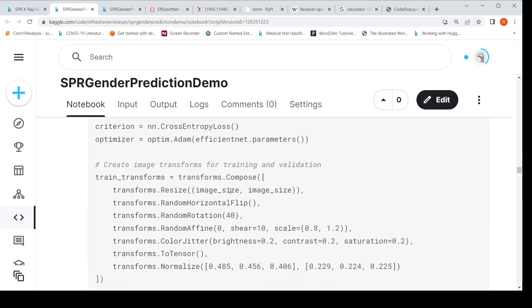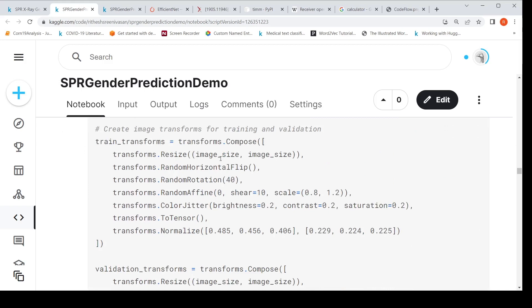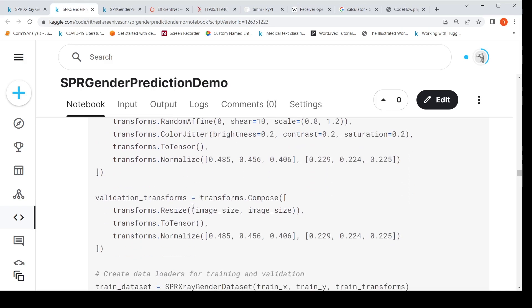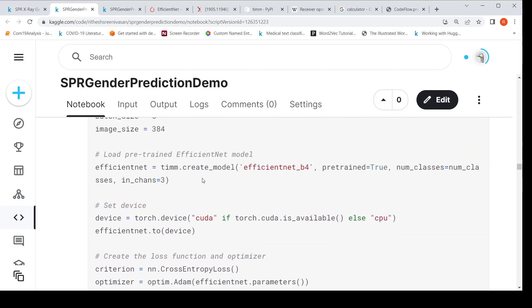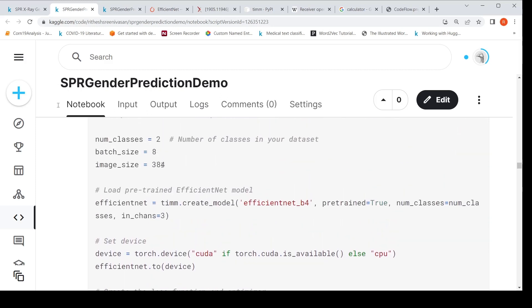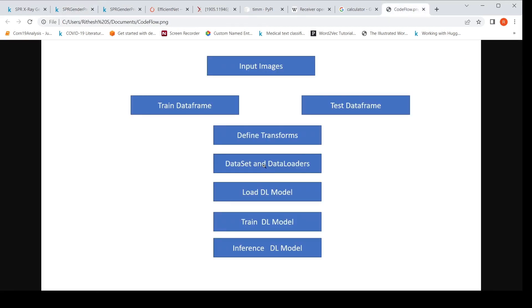I also define transforms. For training, I perform augmentation such as random horizontal flipping, rotation, and affine transforms. For the validation and test datasets, I do no augmentation — just a resize. The resize is important because the EfficientNet model accepts a particular input size. The data loaders are not yet created, but let's move to the next step of loading the deep learning model.